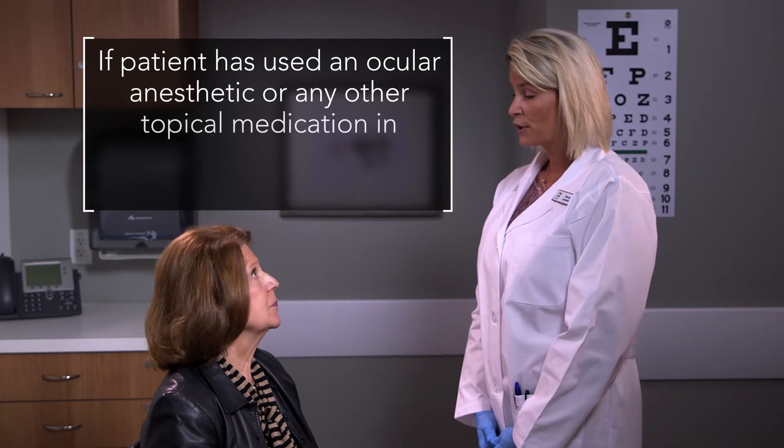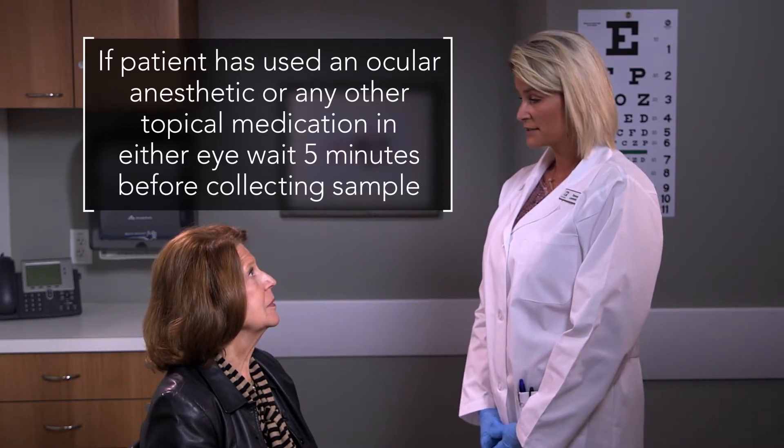Before administering the test, be sure the patient has not used any ocular anesthetic or any other topical medication in the eye. If so, wait at least five minutes before collecting a sample.